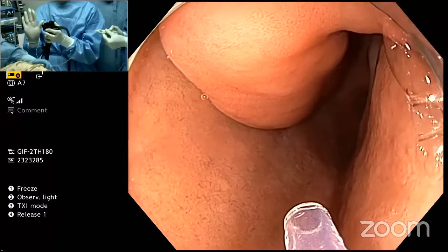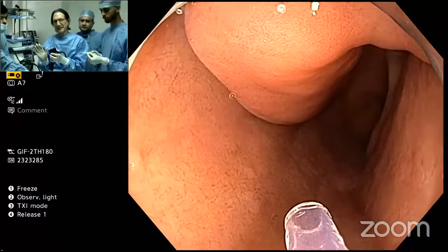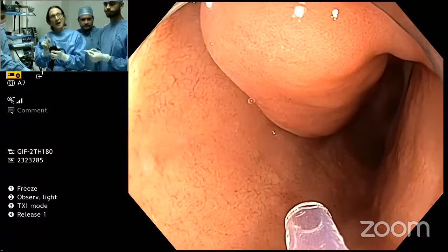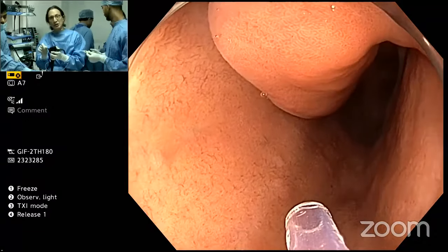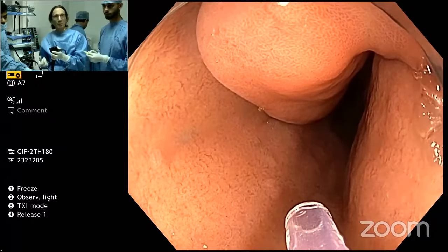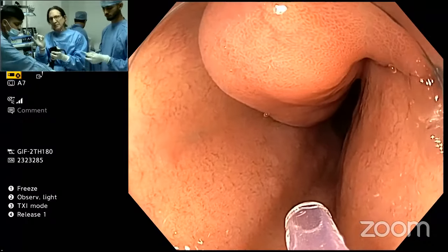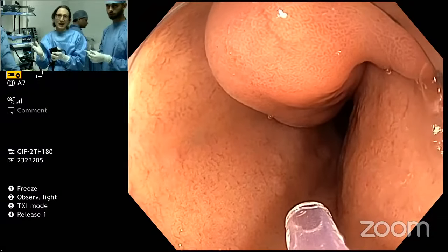Patient safety always first. And you never do a procedure with the patient moving. And so your anesthesiologist is your best friend. And anesthesiologists, by the way, never get the credit they deserve. They're the ones who keep our procedure safe. And back when I was in Germany, I was giving the propofol myself. And I can tell you today, that's inconceivable to me, that the endoscopist would be doing the anesthesia at the same time as doing endoscopy.